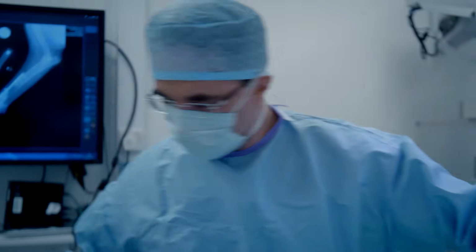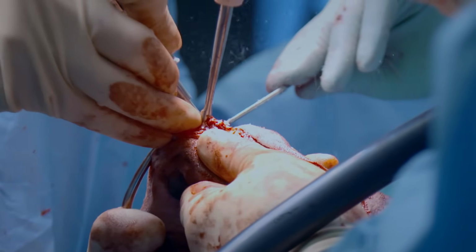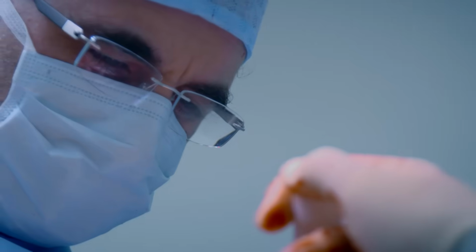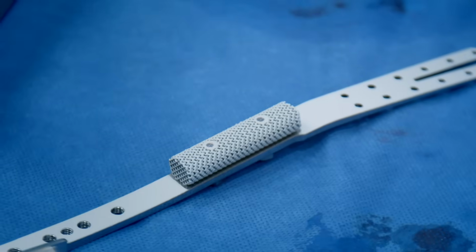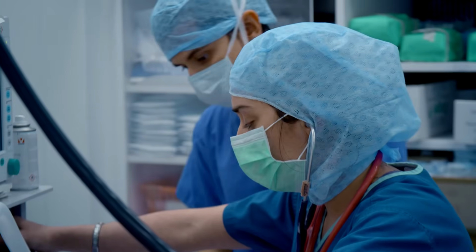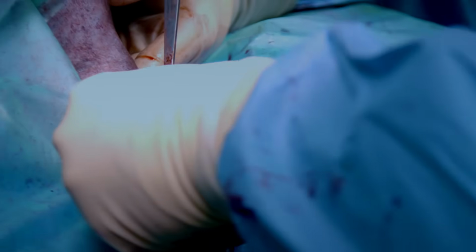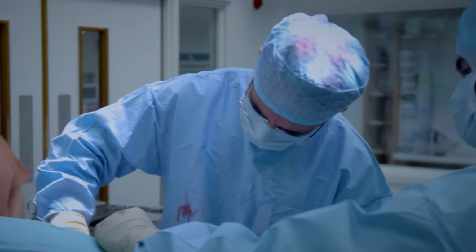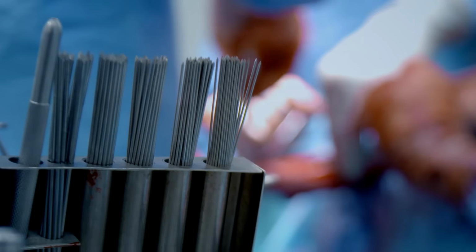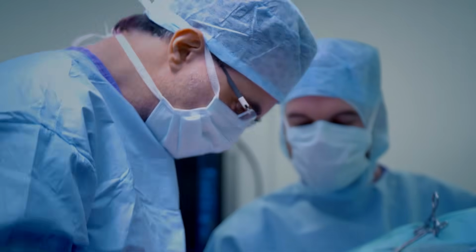So I'm cutting into the wrist now, splitting all the bones of the wrist open. So I'm going to fuse them all together. Next, he removes the dead bone. Okay, I think I'm at about the level of living bone, top and bottom now. I'm going to put the mesh onto the base of the bone, and now I'm going to lever it up onto the top bone. No, can't do that. The most important thing is not to sacrifice these blood vessels or nerves. That's absolutely vital. Otherwise the foot will become rotten. There we go, we're getting there now. Hold that.